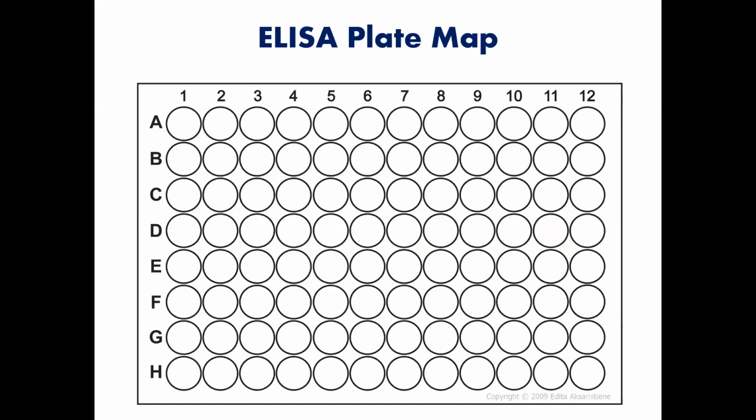Are oral HIV tests a type of lateral flow? Yes, they are.